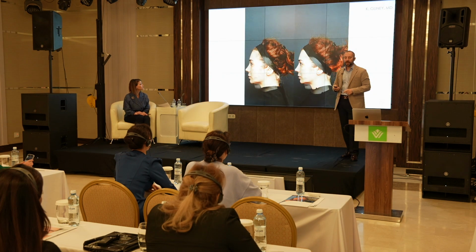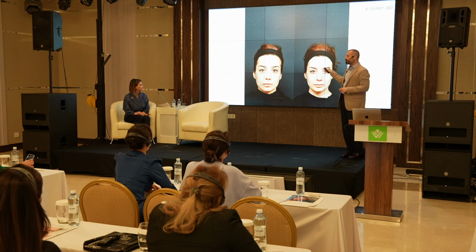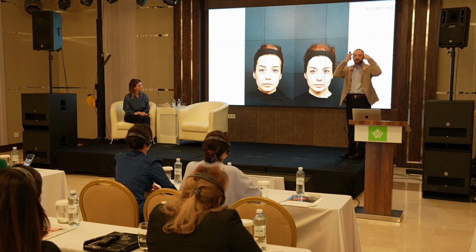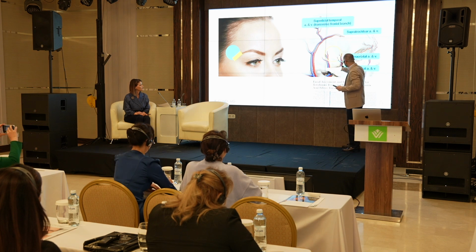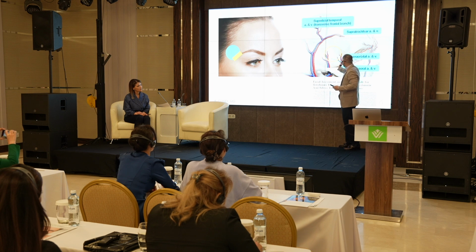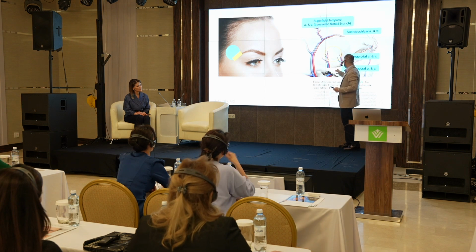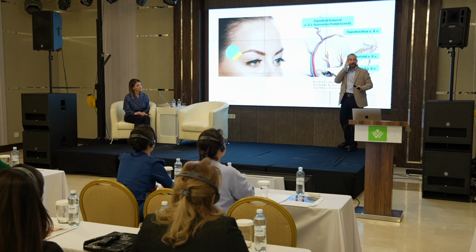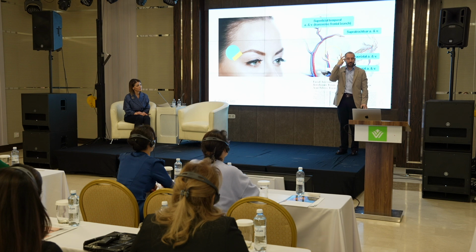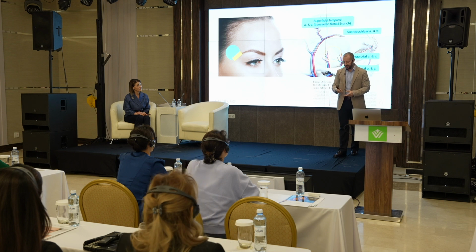So, as you see, you can see a little bit fresh looking. You can see only 0.4 subcutaneous injections, and you can see the brow lift with this technique. Also, the gunshot, I told you, deep vessels, it's shown here, but these deep temporal arteries are a little bit back from the rim, approximately 1.1 centimeter or 2 centimeters back to the orbital rim. So when you are close to the orbital rim, deep injection is quite safer for the gunshot deep injections.